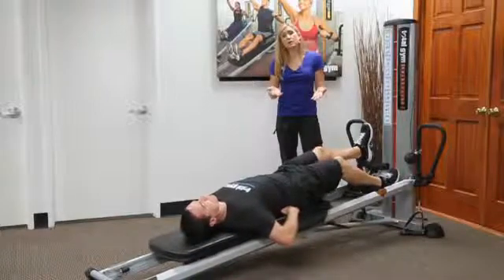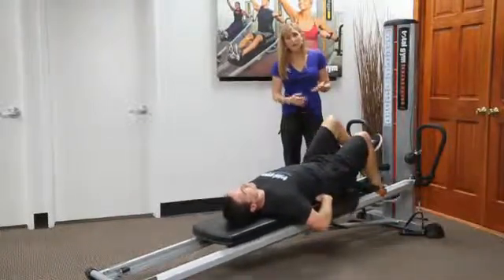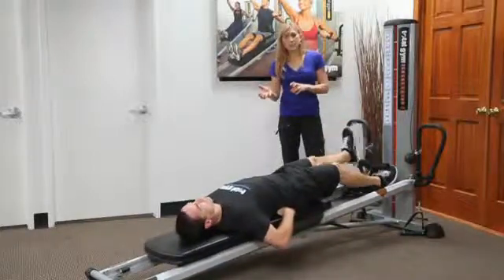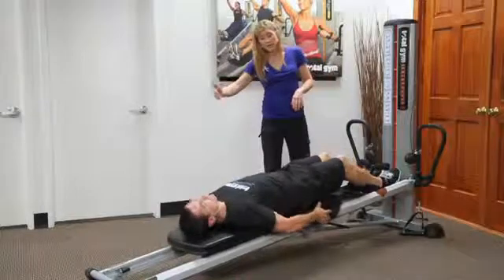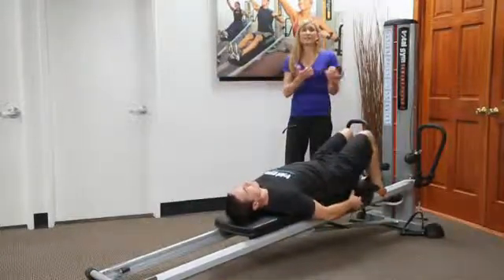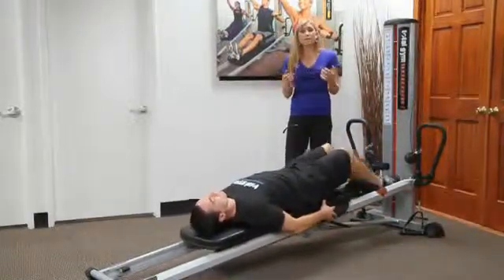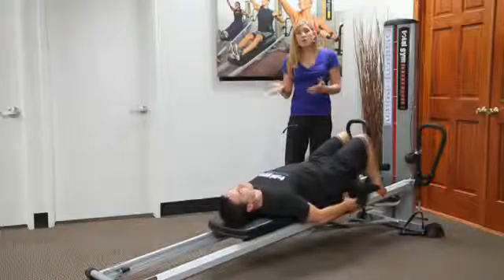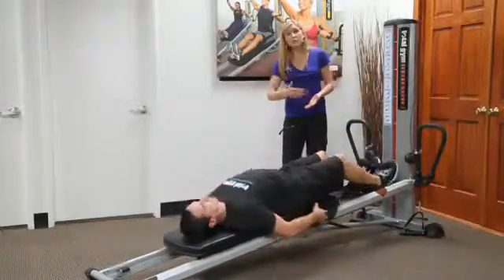So Jeff here got on the board pretty readily, and he positioned himself right at the top edge of the glide board. Oftentimes when our patients first get down onto the machine, they'll position themselves further down on the board, and when they go to do the hamstring curl, it's called topping out. That's exactly what you'll hear. You'll hear the board come to the top, and they don't necessarily feel like they're getting a good range of motion. So when you cue someone to get on the machine, you might have them scoot up a little bit.